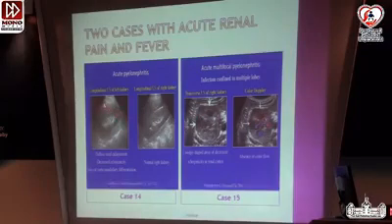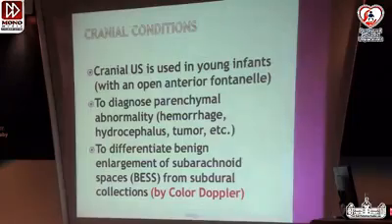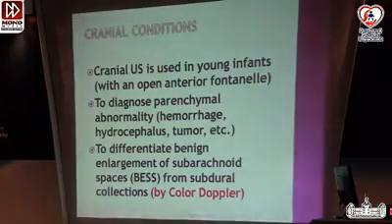In the diffuse form, compare the diseased side with the normal side: enlarged kidney with loss of corticomedullary differentiation. In the multifocal type, you can see these hypoechoic areas within the renal cortex without vascularity. So diffuse and multifocal pyelonephritis. Let's go to the cranial conditions.